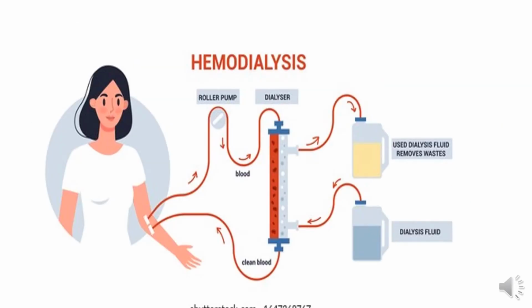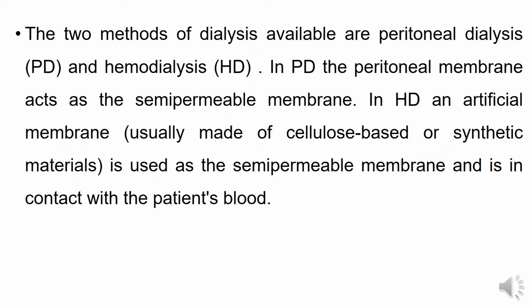This is one of the hemodialysis. We will discuss hemodialysis in the hemodialysis portion. Mainly we have two types of dialysis: hemodialysis and peritoneal dialysis. Firstly, we are going to see peritoneal dialysis.